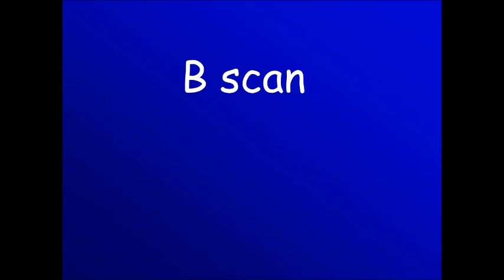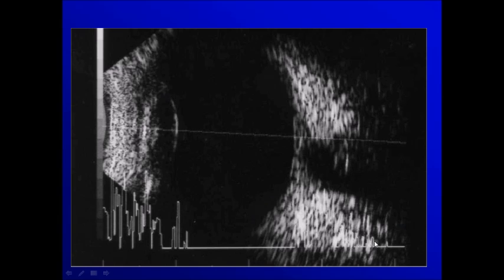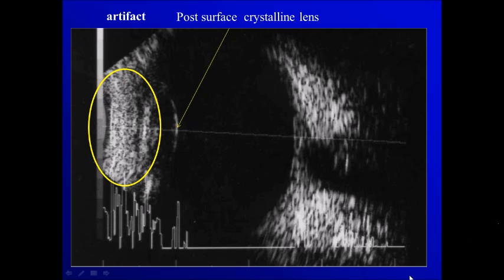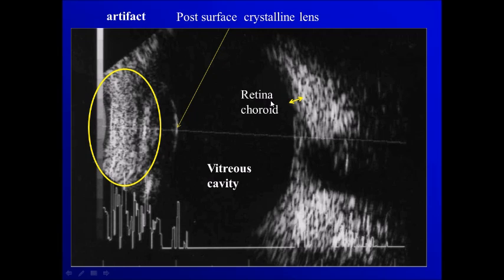I want to start this series by discussing the normal structures we see in any B-scan. This anterior part is an artifact. Then sometimes we are able to see the posterior surface of the crystalline lens. Then we have the vitreous cavity. Here we have the layer of retina and choroid. We cannot separate the retina and choroid — they are one layer except in case of retinal detachment. Then we have this hyperreflective layer of the sclera.